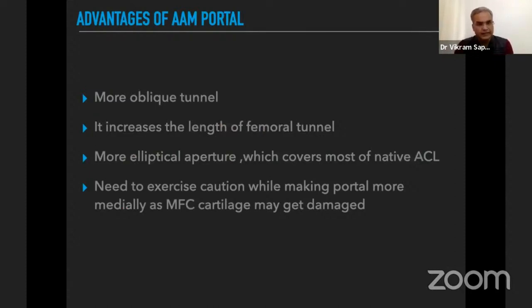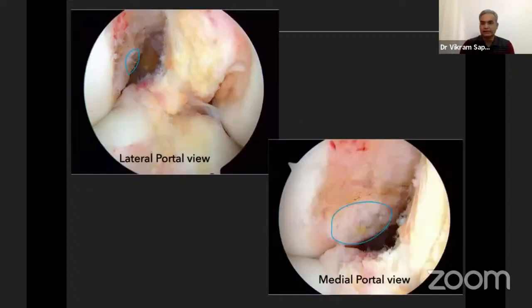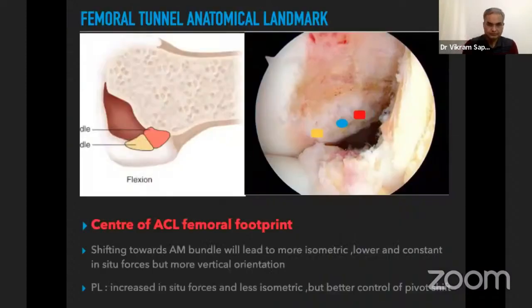When making the accessory anteromedial portal, we must exercise caution when shifting it more medially — assess from inside that it is not too close to the medial femoral condyle cartilage, which may get damaged during drilling. From the lateral portal we see a side view of the femoral footprint, but through the accessory anteromedial portal we get a complete end-on view.